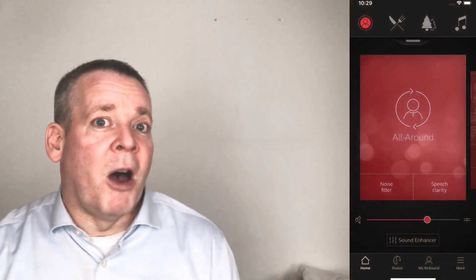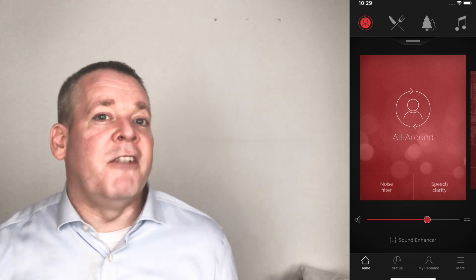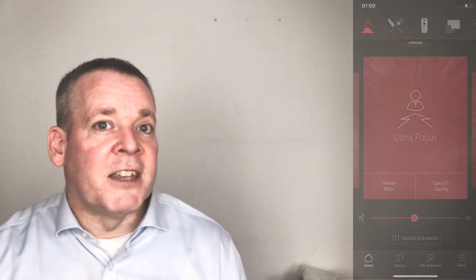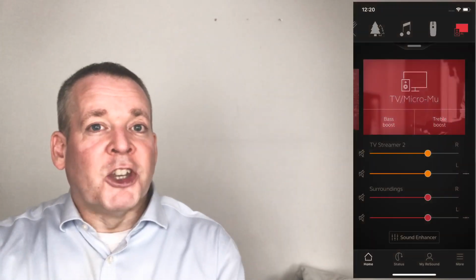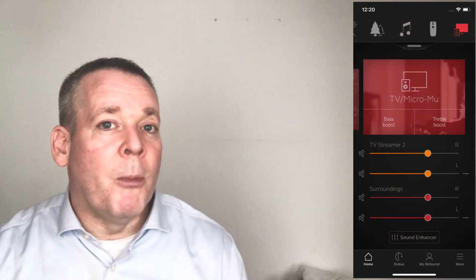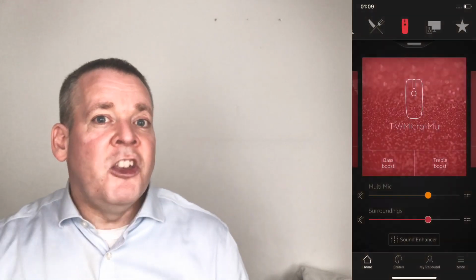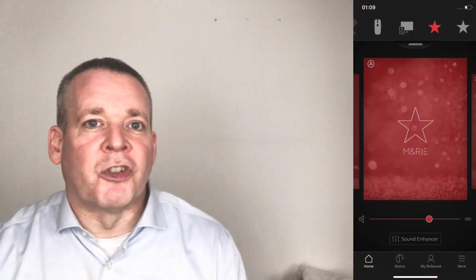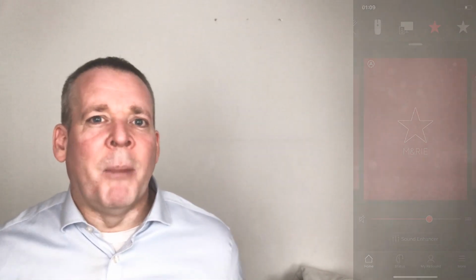Now, in terms of another assistive device, there is the smartphone app. The smartphone app is definitely a firm favourite within the hearing aid industry. It's very visual. If you do have any additional programs like the Ultra Focus, you can see straight away when you've switched into that. You can see when to switch into your TV stream or remote mic if you've got those optional extras, and you can even create your own programs. I've done that on the app. You can probably see them on the screen. So just an abundance of features.